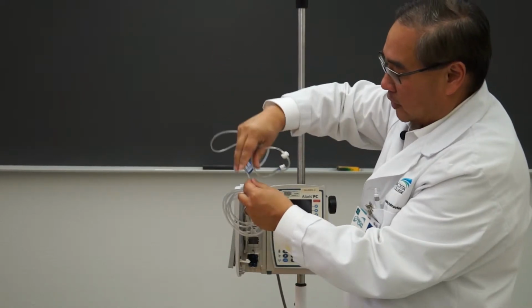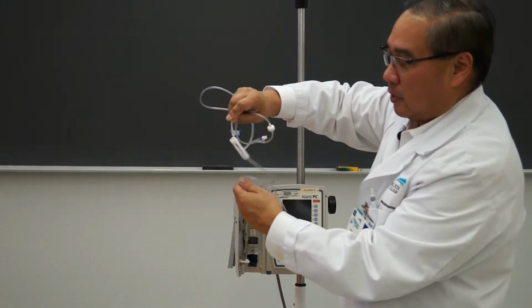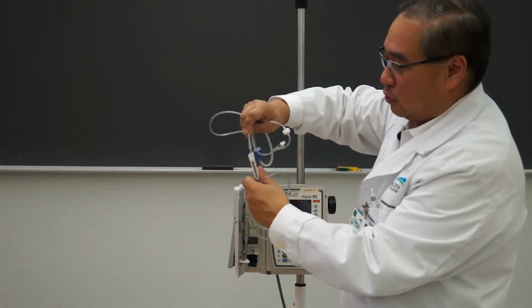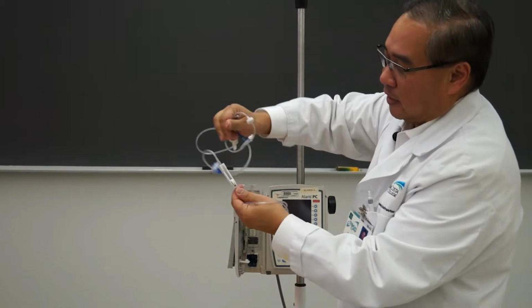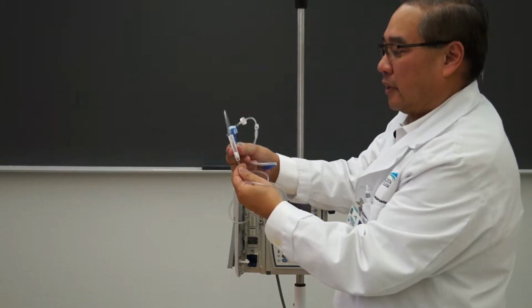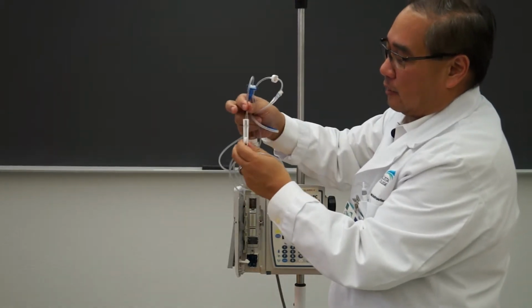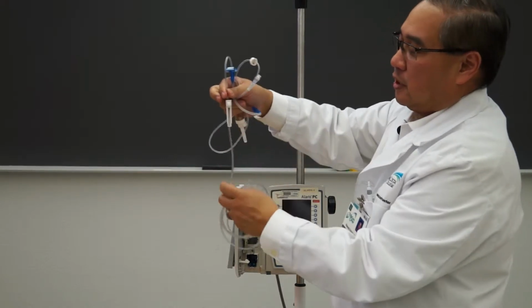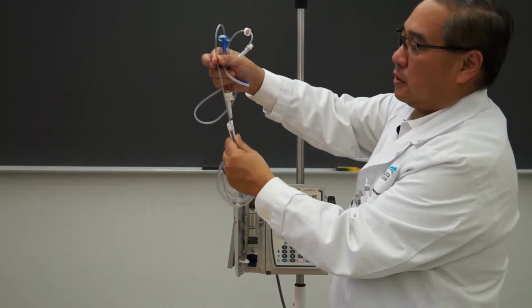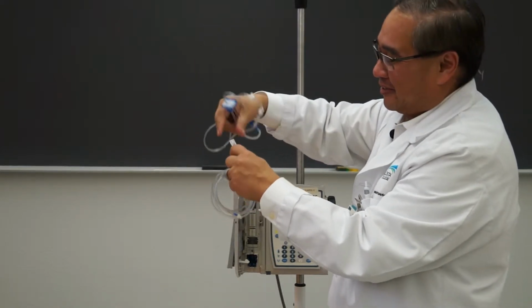If I follow it down, I will then run into the roller clamp. And if you wanted to, you could always put the clamp down. See, if I move my hand on the clamp here, I can't move it. I can't move it up, and I can't move it down. If I roll the clamp upwards, you'll notice then that I could move the clamp up and down. That's how you know if it's open or closed, all right?